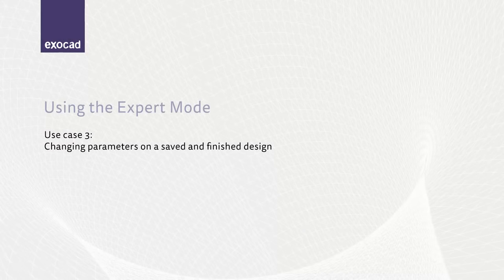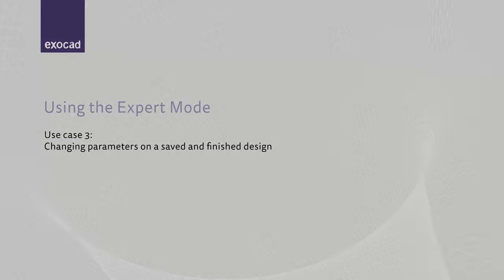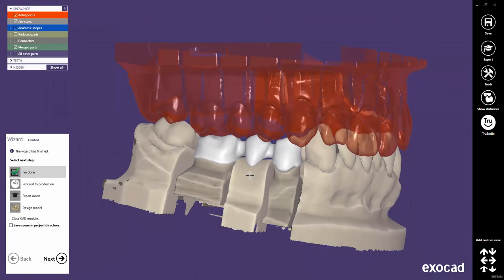The third sample case is a very common example. Imagine you have produced the restoration, but the fit does not meet your expectations. You would now like to change the cement gap settings, and maybe the insertion direction for a saved case. I have loaded a scene file from the DentalDB. The wizard is started automatically. Let's switch to the Expert Mode.